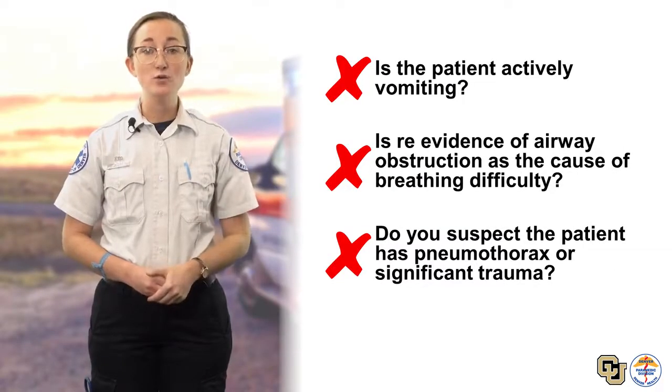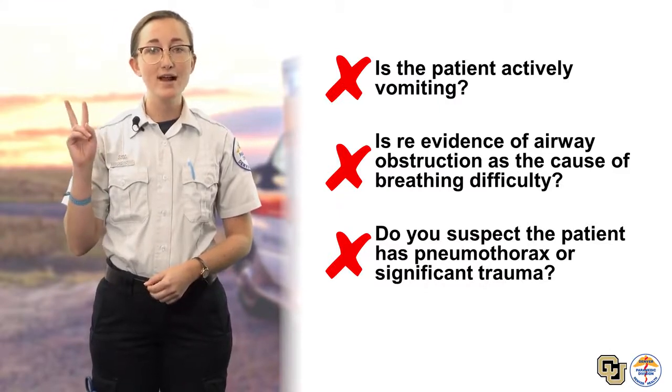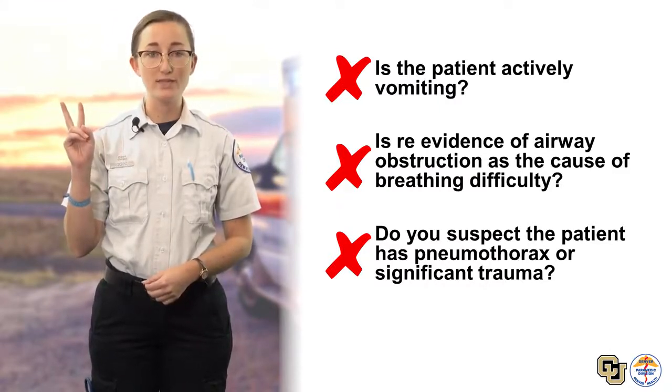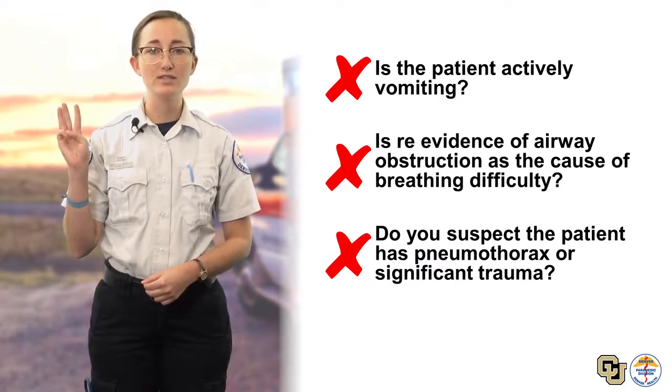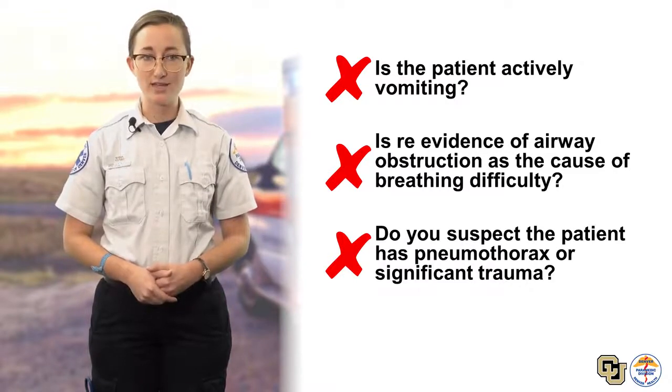And the answer must be no to these questions. Is the patient actively vomiting? Is there evidence of airway obstruction as the cause of breathing difficulty? And lastly, do you suspect the patient has a pneumothorax or significant trauma? If our patient is eligible to use the CPAP, let's begin our skill.